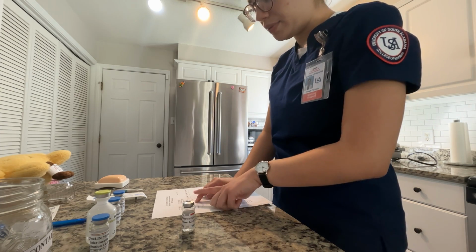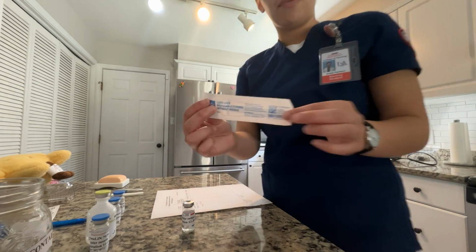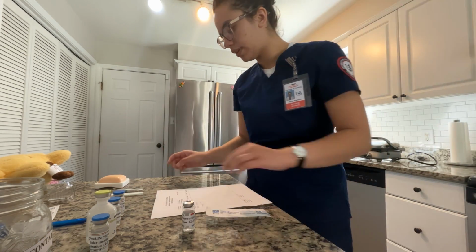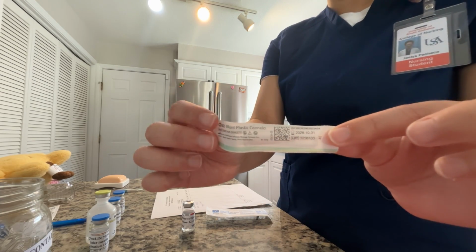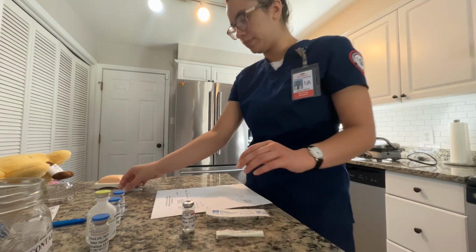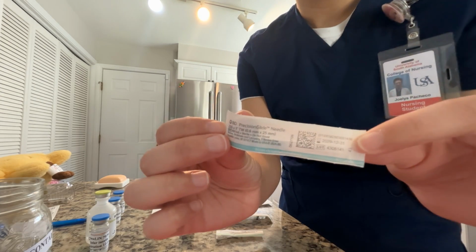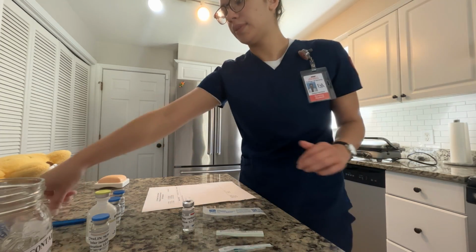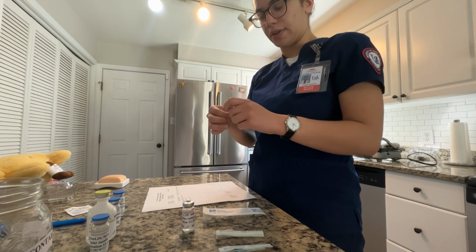So next, he is to receive this medication IM. So for an IM injection, we would need a 3 milliliter Luer-Lok syringe, a blunt plastic cannula, and a 23 by 1 inch precision needle. So now I'm going to draw my medication for correct dose.